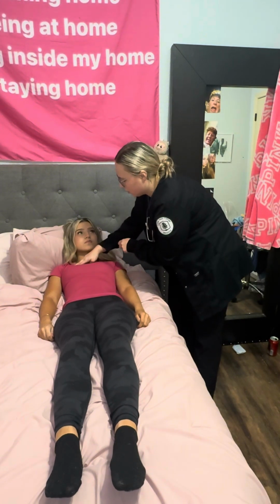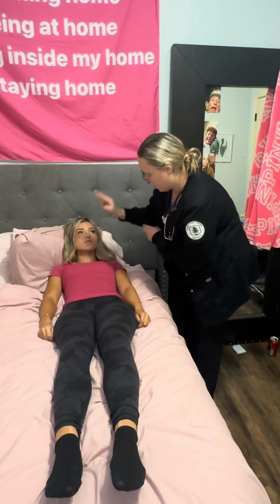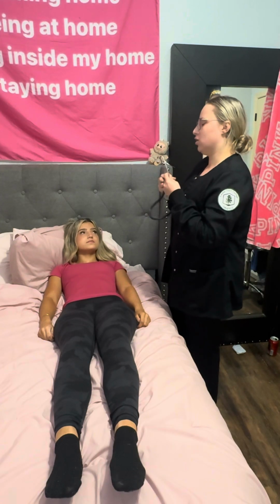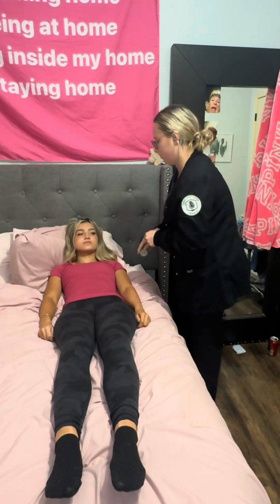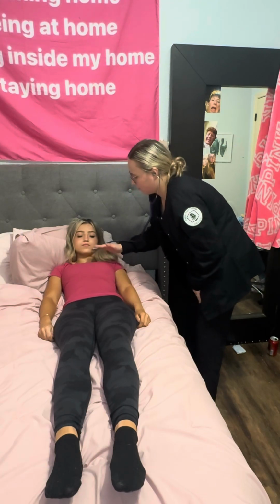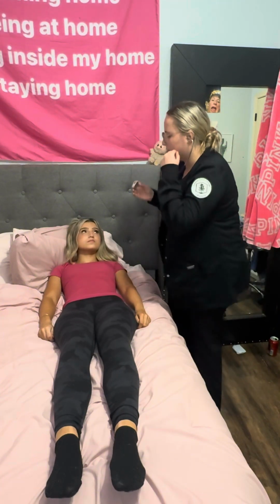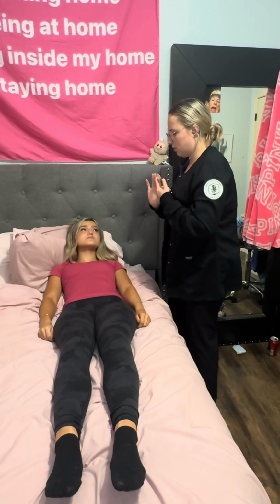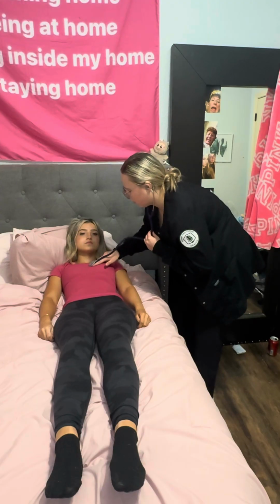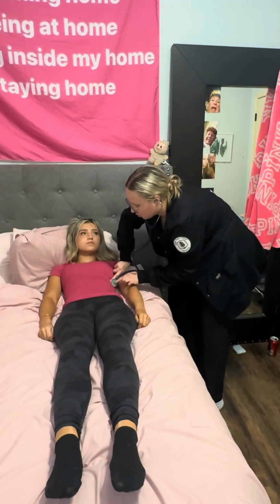This is your aortic, your pulmonic, your Erb's point, your tricuspid, and your mitral. Okay, so I'm going to do the same thing, but I'm going to listen to it with the diaphragm of my stethoscope. Aortic, pulmonic, Erb's point, tricuspid, and mitral. Okay, good. Same thing, just going to use the bell side, the small side. Aortic, pulmonic, Erb's point, tricuspid, and mitral. And the mitral is also your apical pulse.